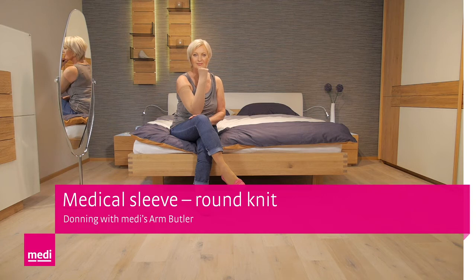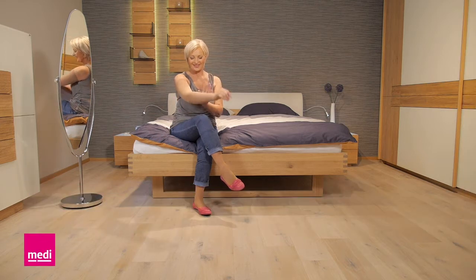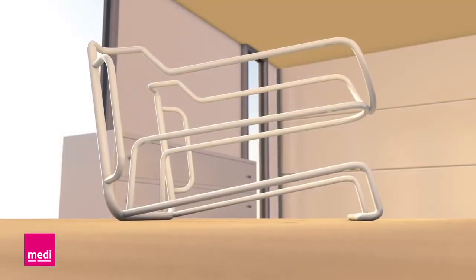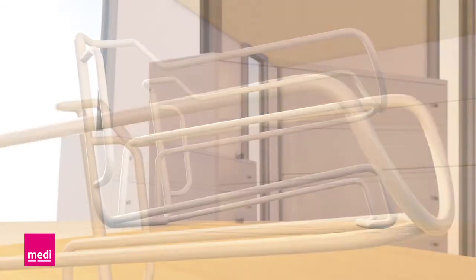How do you put on your MidiVen arm sleeve properly with a Midi Arm Butler? This video clip will give you some valuable tips because it's really easy once you know how. The Midi Arm Butler is easy to use — it pre-stretches the material and increases the diameter so you can put on the arm sleeve comfortably.